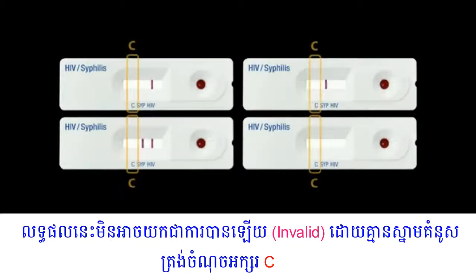If no line appears near the letter C, conduct the test again with a new test device and new disposable capillary pipette.